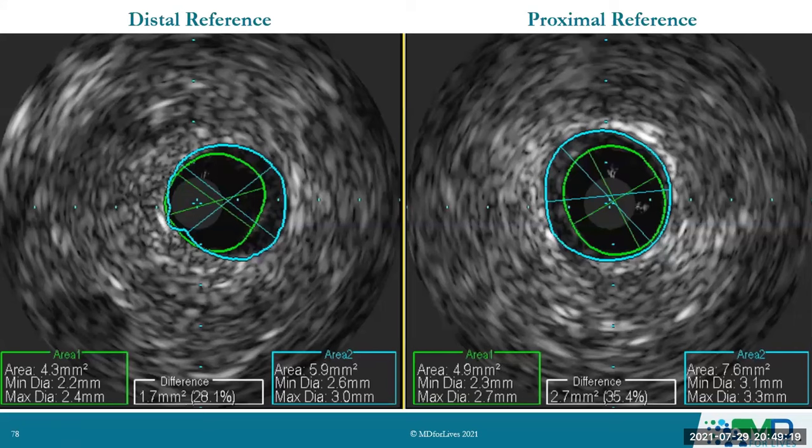The distal reference, so 28% plaque burden. The average diameter, 2.8 millimeters of the vessel, 2.3 millimeters of the lumen, so 2.8 becomes 2.7, 2.6, 2.55 millimeters distally, or 2.3, 2.4, 2.55 proximally, so agreement. So 2.5 millimeters is the distal reference. The proximal reference is in an area with 35%, so less than 50% plaque burden, 3.2 millimeters by vessel, 2.5 millimeters, so 2.75 by lumen, or 2.95 by vessel. So 2.5 distally, 2.75 plus proximally, get to work.